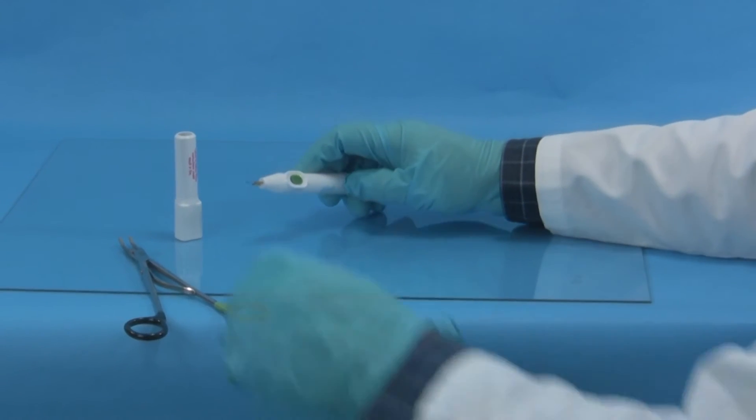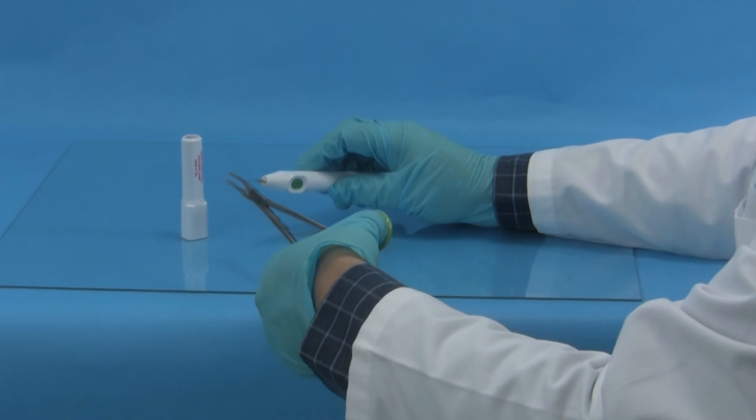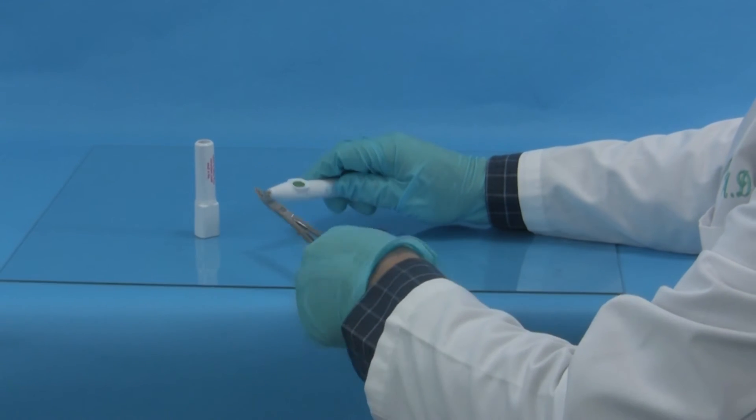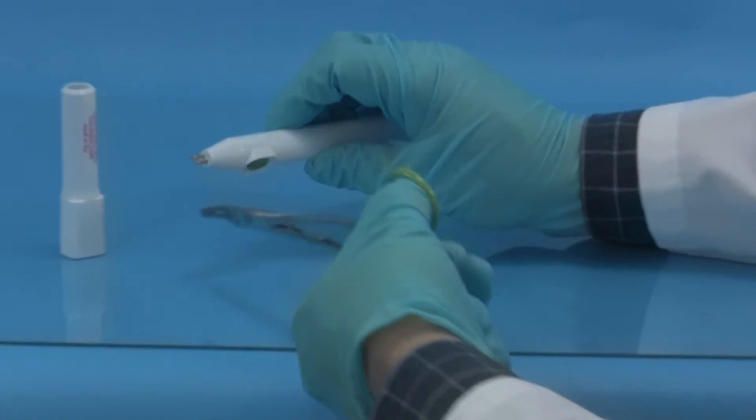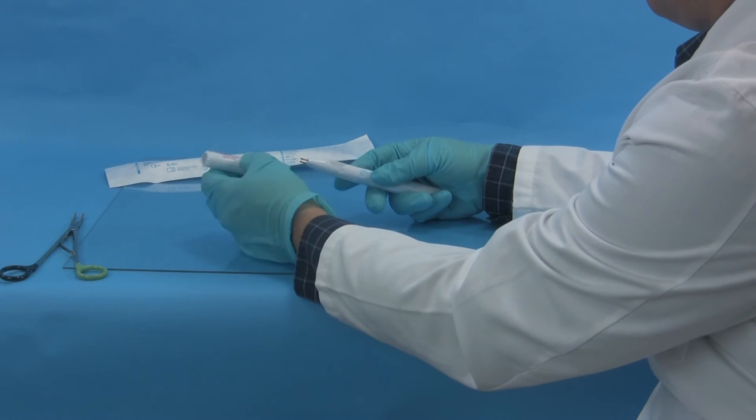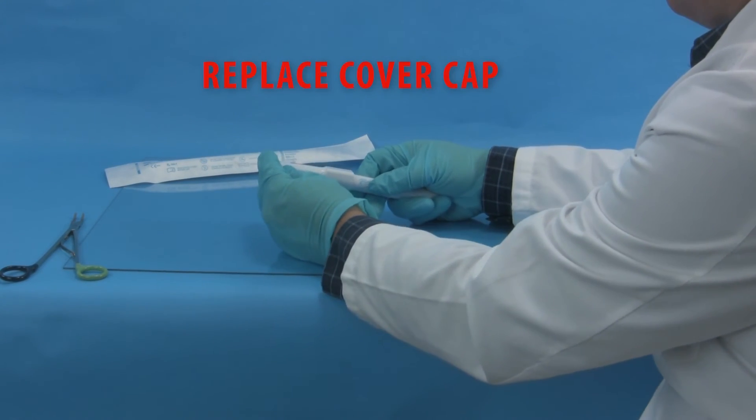To properly dispose of the cautery, use hemostats to break off the tip and replace the cover cap. It is important to replace the cover cap.